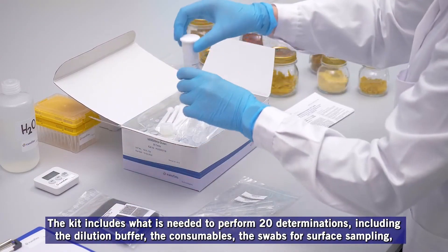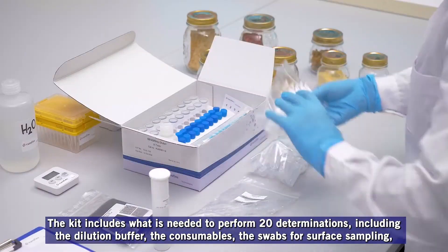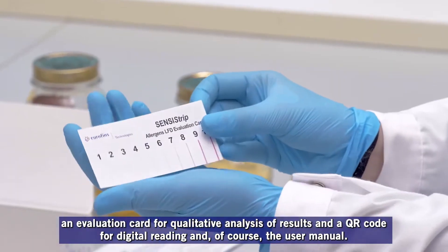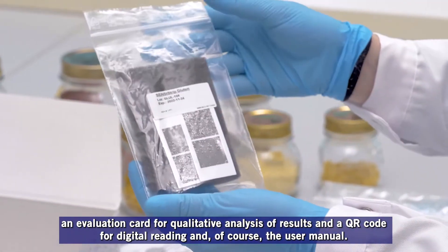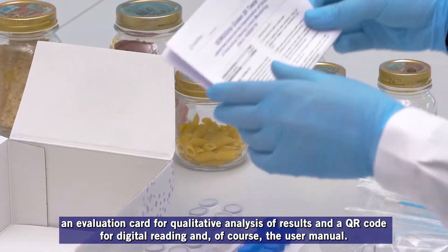The kit includes what is needed to perform 20 determinations, including the dilution buffer, the consumables, the swabs for surface sampling, an evaluation card for qualitative analysis of results, a QR code for digital reading, and of course the user manual.